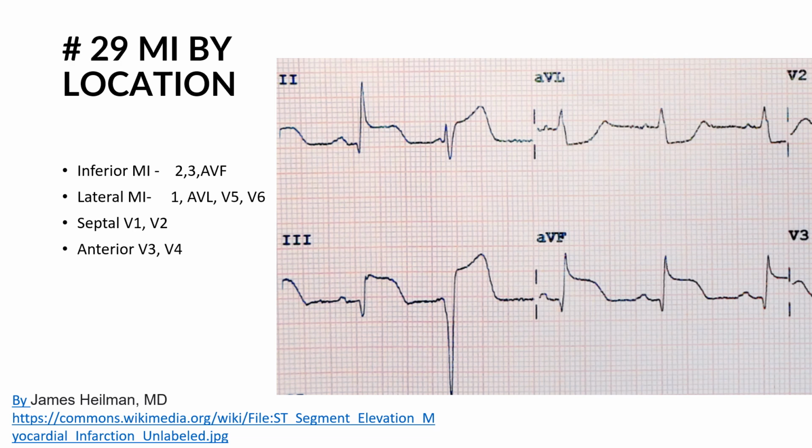The other thing, and this goes back to understanding how the EKG is set up, is that right here are your ventricles, and we're going to pretend we have an electrode centered here in the heart. Here are the atria. We don't care about these, but I'm drawing them for the sake of illustration, just to keep your orientation.